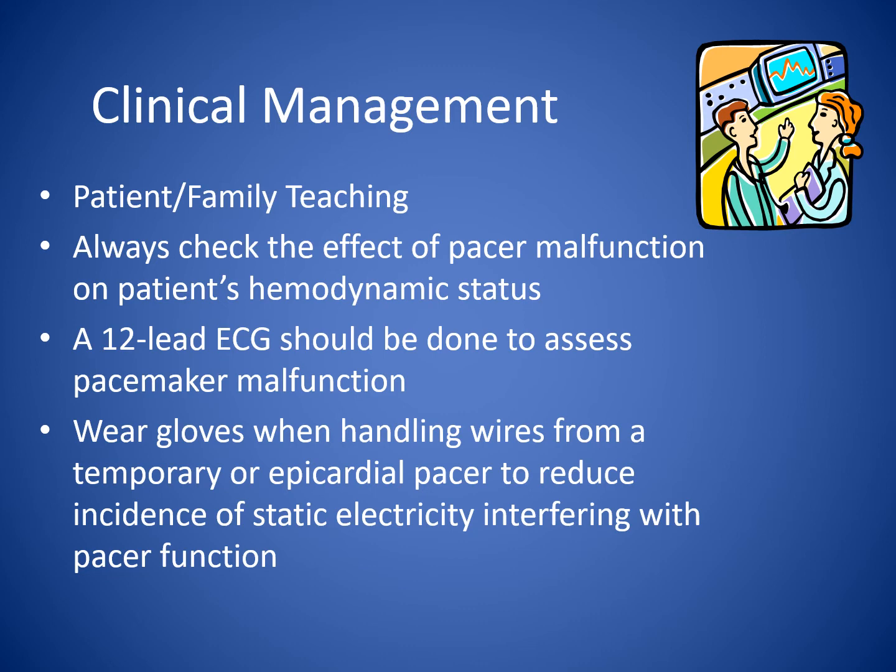But there are some new insertion guidelines which include activity restrictions such as a sling. Oftentimes you want to restrict arm movement, and that's part of that patient-family teaching. We had a permanent pacer lead dislodge recently. Watch for signs and symptoms of infection or bleeding at the insertion site. So these are all things that you want to monitor for your patient. And reps will usually bring in interrogation devices for specific brands so they can monitor and make adjustments to these settings.